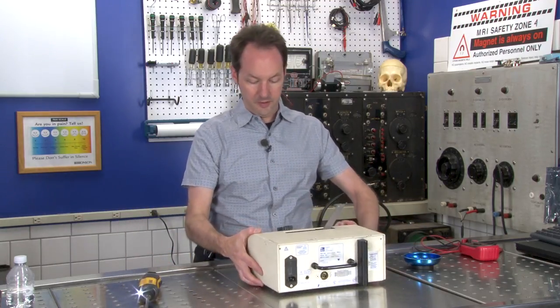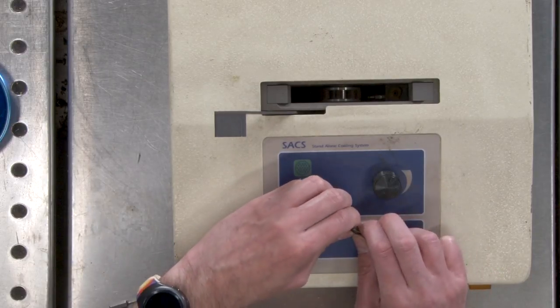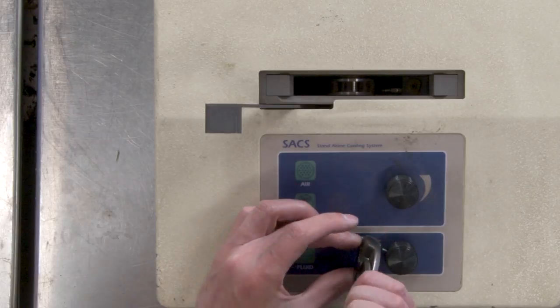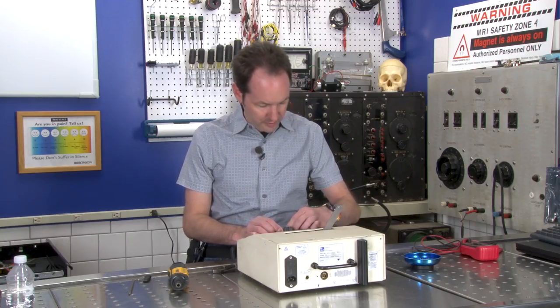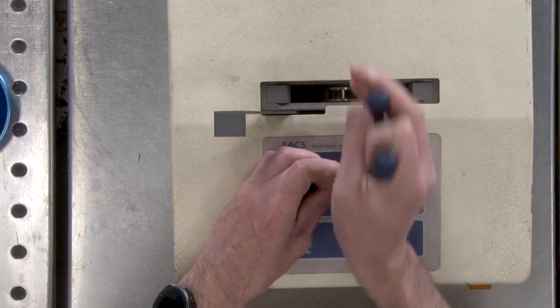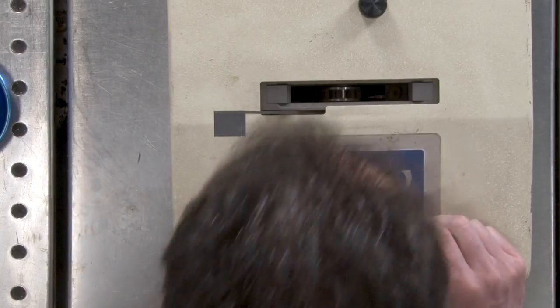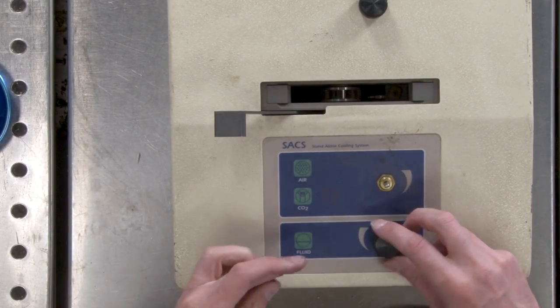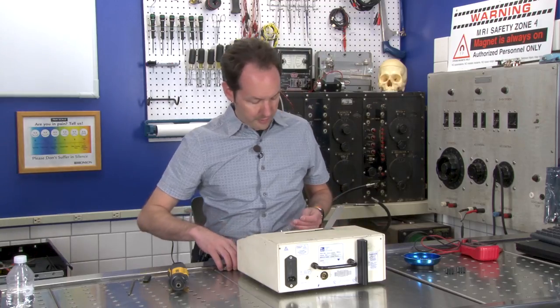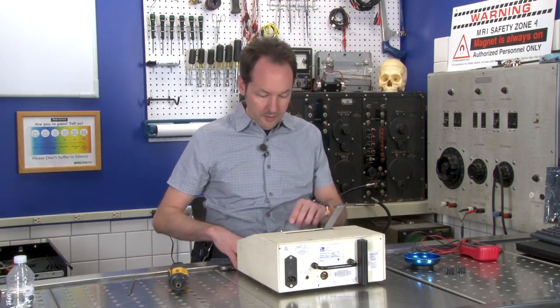Now I'm going to flip it over and pop the knobs — oh wait, I've got little grub screws. One comes right off, the other is on a bit more enthusiastically because there are two grub screws. That one comes right off. So take the knobs off before you really get into it.